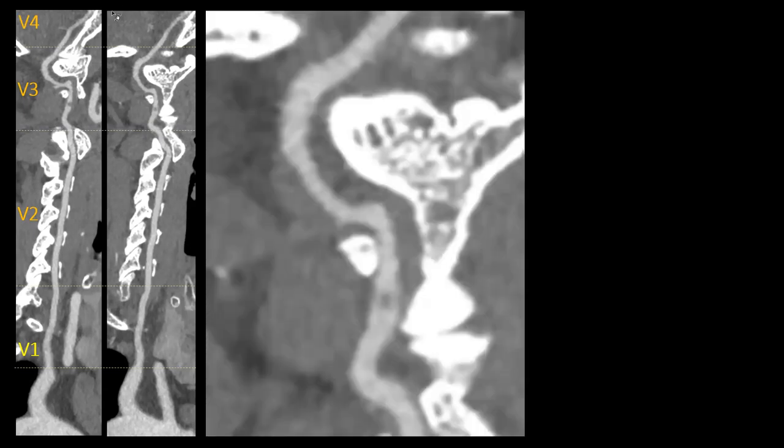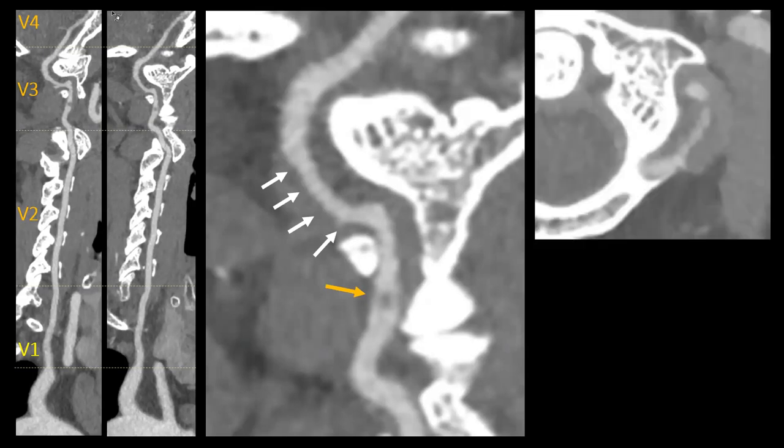This is a trauma patient who had a posterior circulation stroke. I'm not showing you the unenhanced CT images. We're just going to focus on the CT angiography in this patient. This is the anatomy illustrated once again. We have the pre-foraminal segment, the foraminal segment, we have the V3 segment and the V4 segment. Let's magnify the V3 segment because that looks a little bit abnormal. It's very irregular if you look carefully. And we also have here something located centrally within the vertebral artery. What could this be? Keep in mind, this is a trauma patient. The patient suffered a vehicle accident.